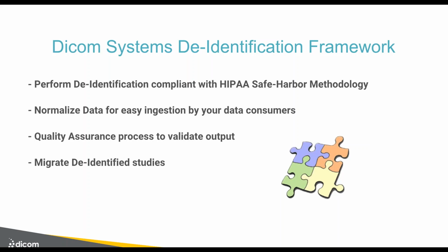And so in the case of HSS, not that they've been hit with any security breaches in the past, but they wanted to make sure that anything that hit the servers in AWS was already de-identified. And so that's why we implemented that QA server in their DMZ to ensure that the first server did its job correctly. And so that's one way to do it.